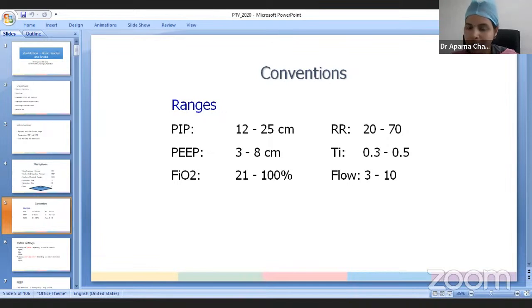And this itself will impair the lung mechanics and result in increased pulmonary vascular resistance. Whereas excessive PEEP can also lead to over distension of the lung, hypercarbia and decreased venous return. So we discussed how to begin the PEEP. You assess this based on the underlying lung disease. So usually you will know why you are ventilating the baby. So if the baby's lungs are normal, we begin with a PEEP of 4.